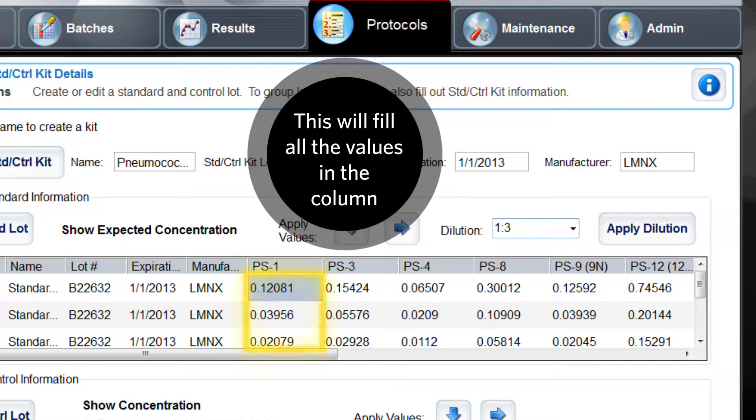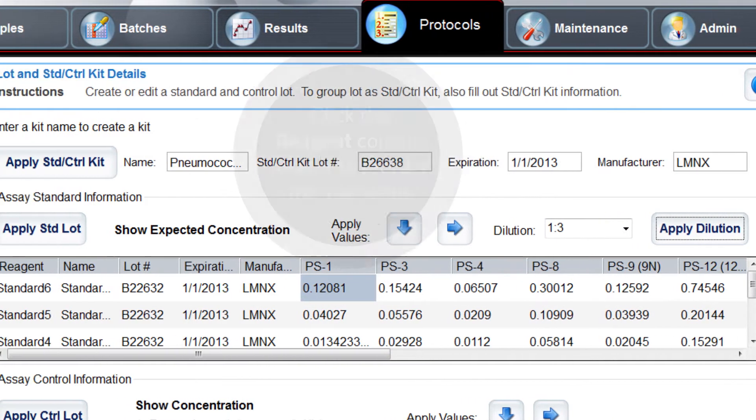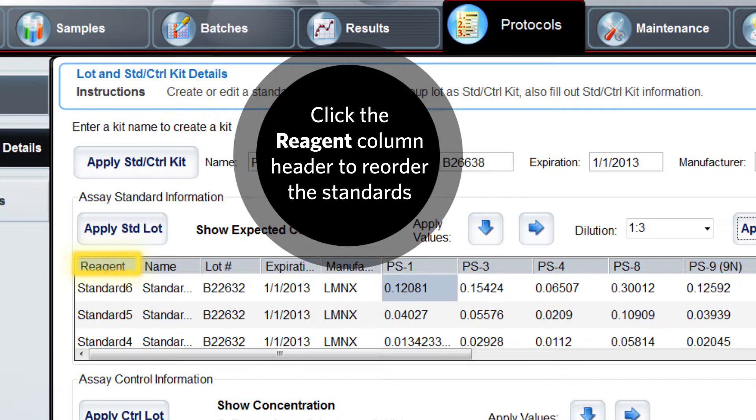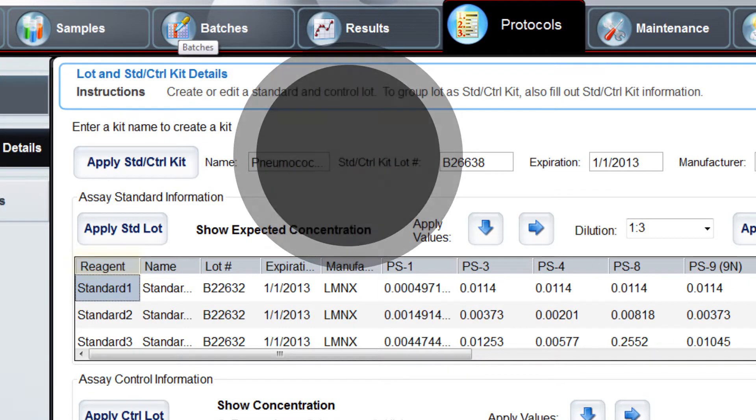This will fill the values down all standards in that column. You may click the reagent column header again to reorder the standards by number.